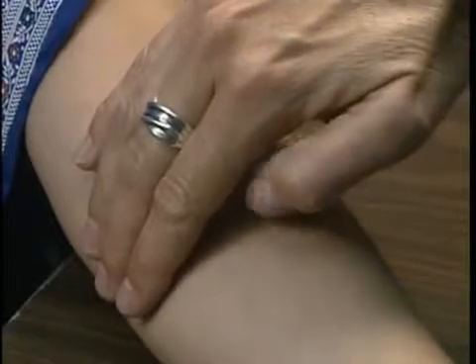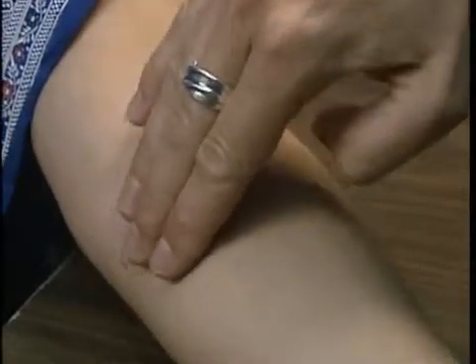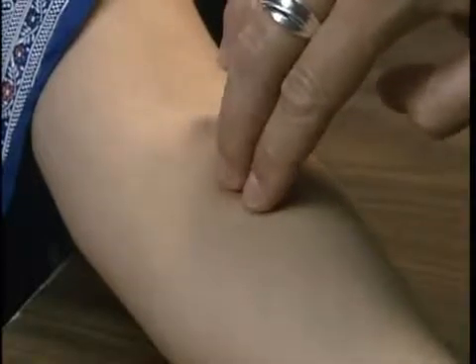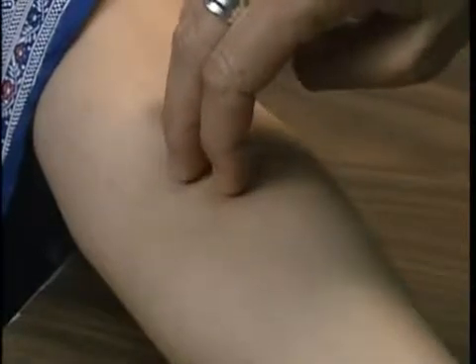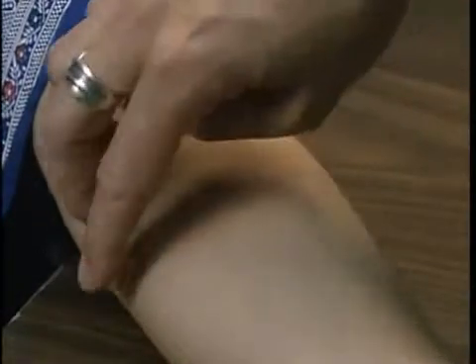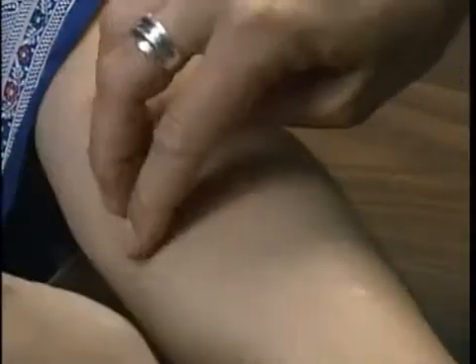To mark the edges of the induration, hold your palm over the injection site with your fingertips at the outer edge of the patient's forearm. Without lifting, move the fingertips from the outer edge of the forearm towards the induration. Rest one fingertip firmly against the induration margin border on one side before marking the margin.